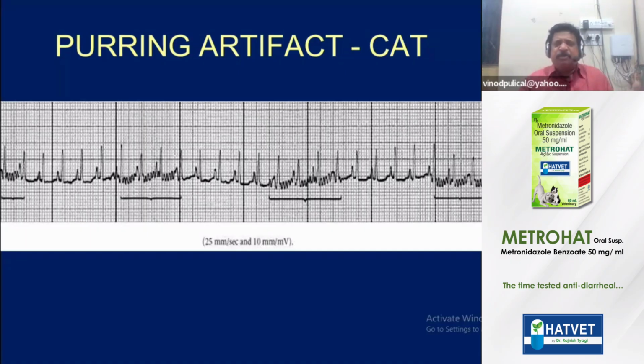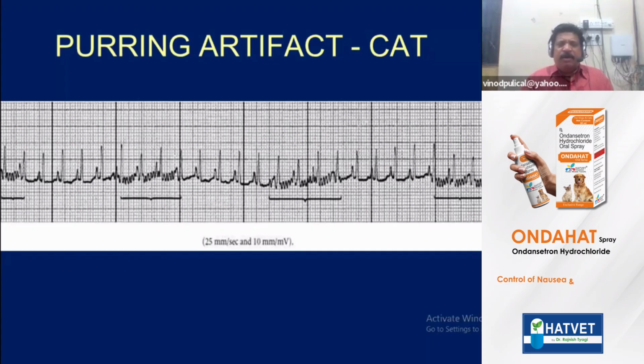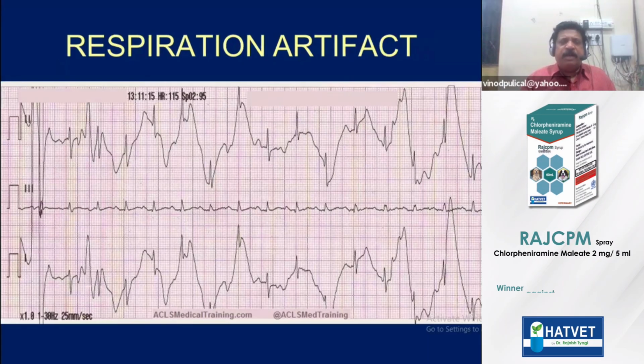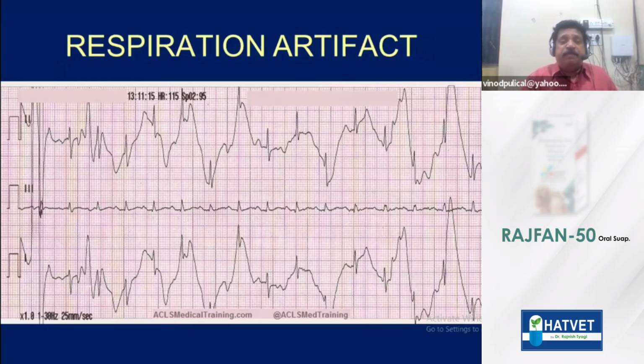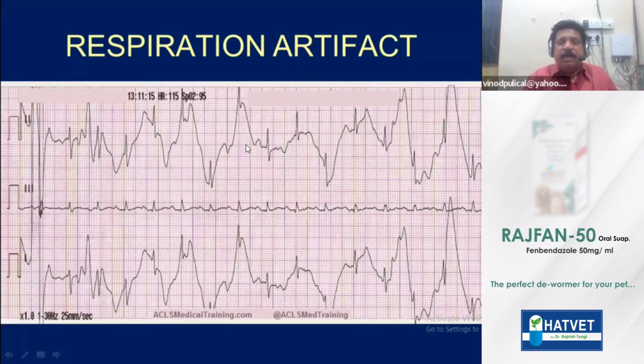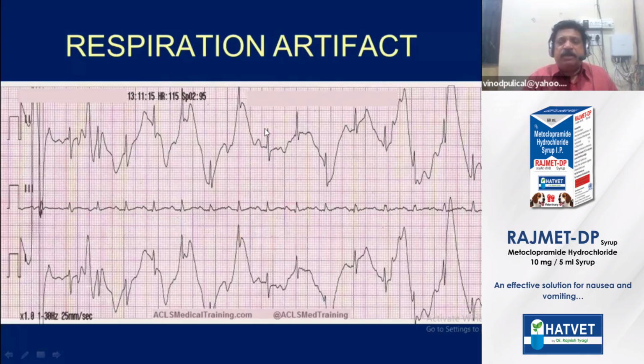This is just to give you a general idea of how cardiology and ECG are. So, my dear friends, we are coming to the last slides. Now, the respiratory artifact. The animal may be gasping too much because we are forcefully making the animal lie down. They may be gasping too much, and you can see the respiratory artifact. So, this is actually the baseline, and here in respiratory artifact, these are not the waves. This is the wave, this is the sinus complex.